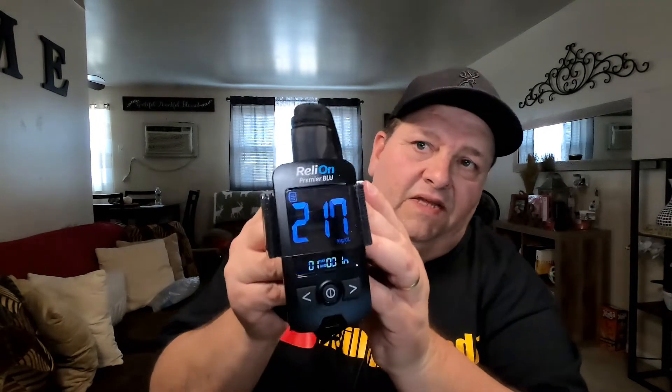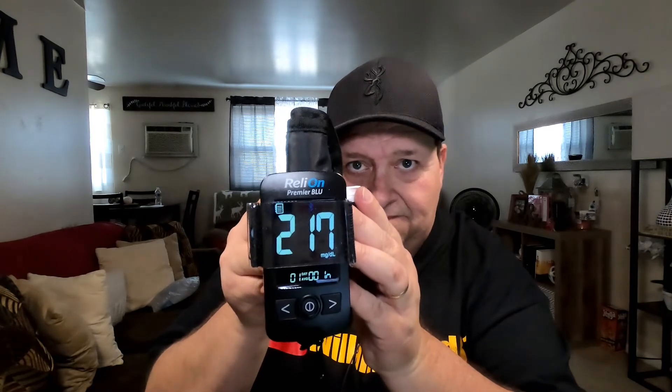You also get this case, and you get the meter itself. Let me turn that on — that's your meter right there, digital. It has a little pocket here where I store my lancets and the lancing device — you know, what you poke yourself with — and then over here it holds your test strips.